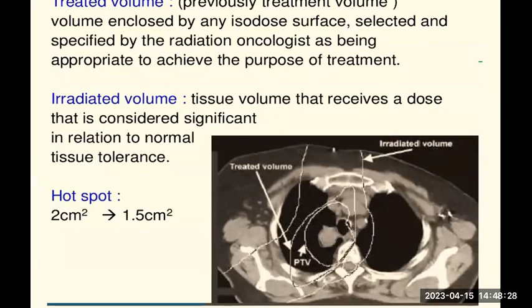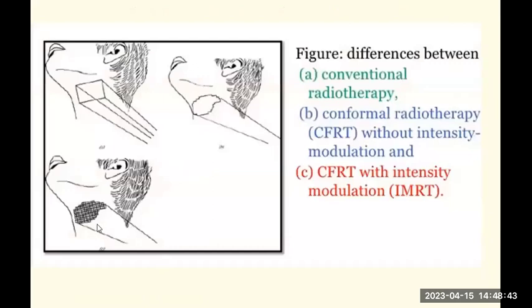An even intensity beam will be applied. There is no intensity modulation. Now we are looking at intensity modulated radiation therapy, where, based on the tumor strength, the intensity is modulated. When you go to the third one, we can find the tumor is marked with dark black stripes, which shows that the beam applied to the tumor is varying.